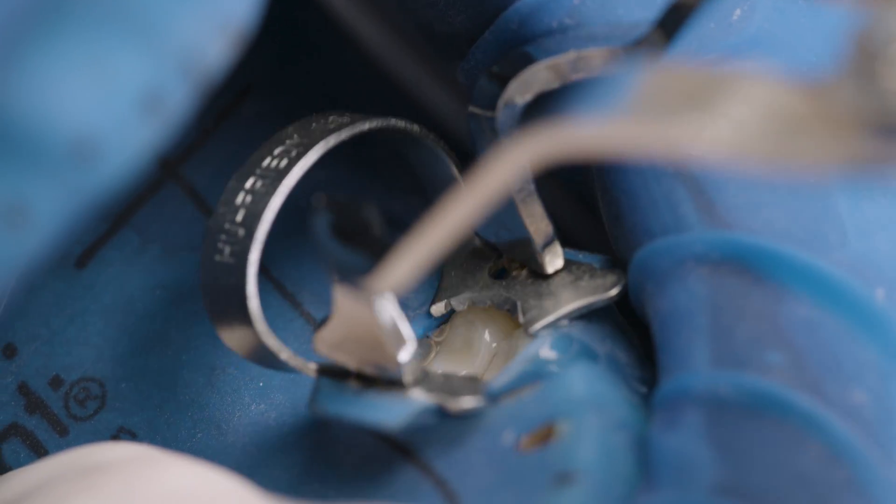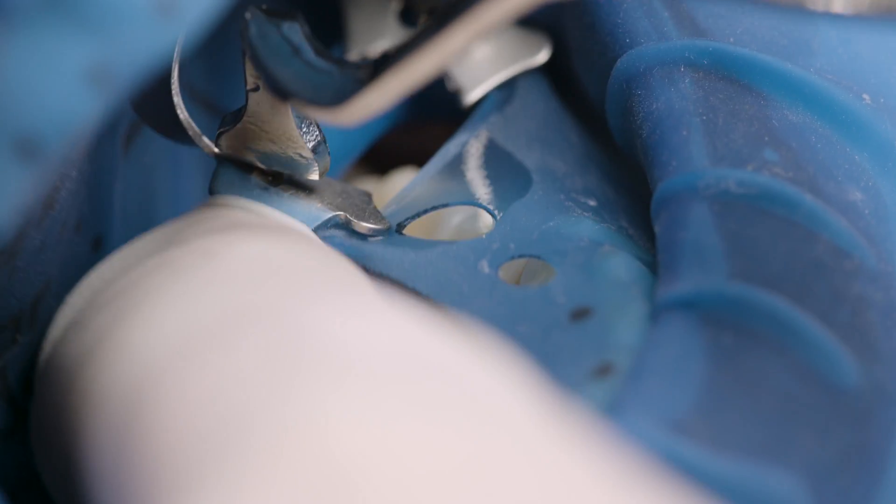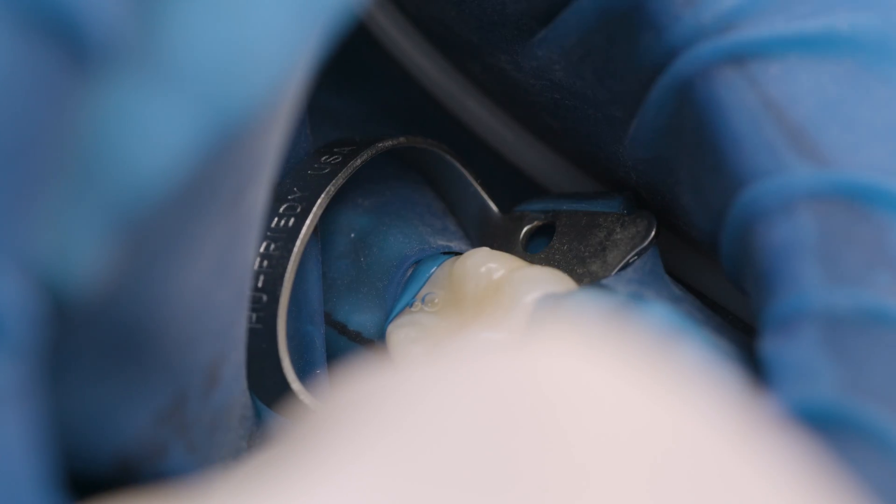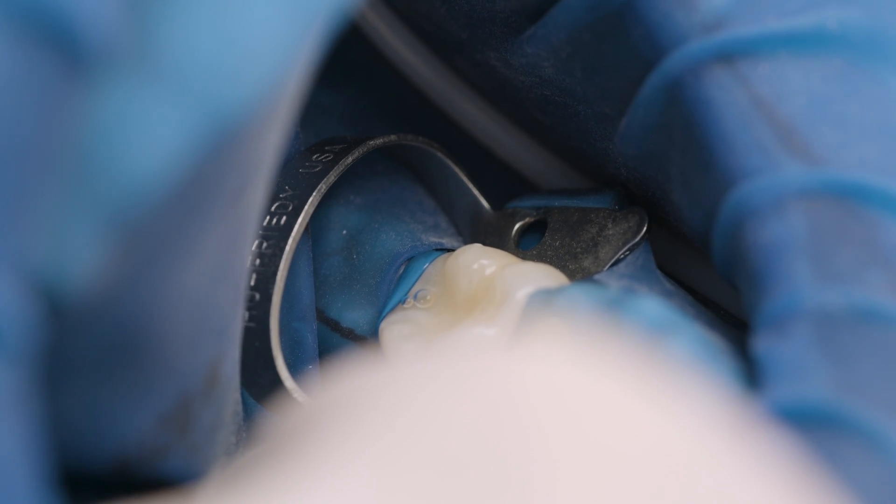In order to place the rubber dam correctly with the clamp, hold the clamp forceps with one hand and the dam with the other. Open the jaws of the clamp and pass over the tooth, only letting go once the jaws are at the level of the cervical third.